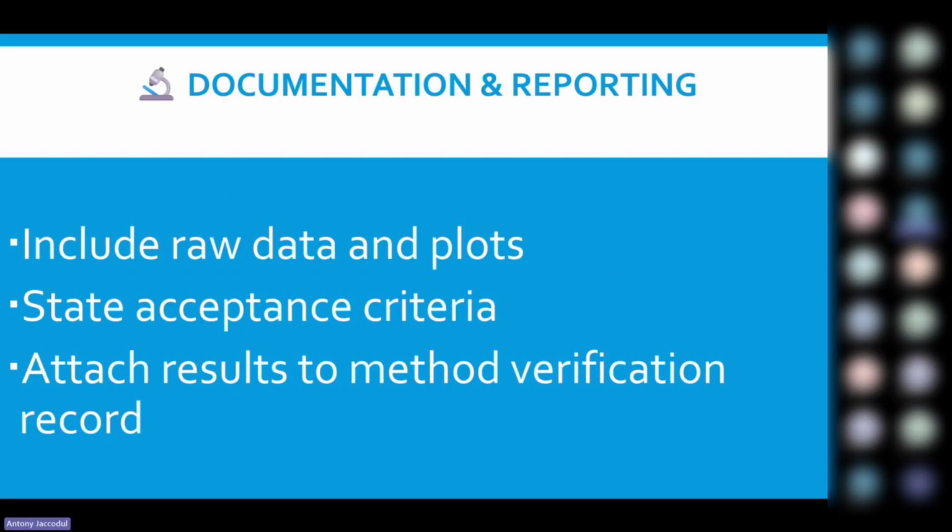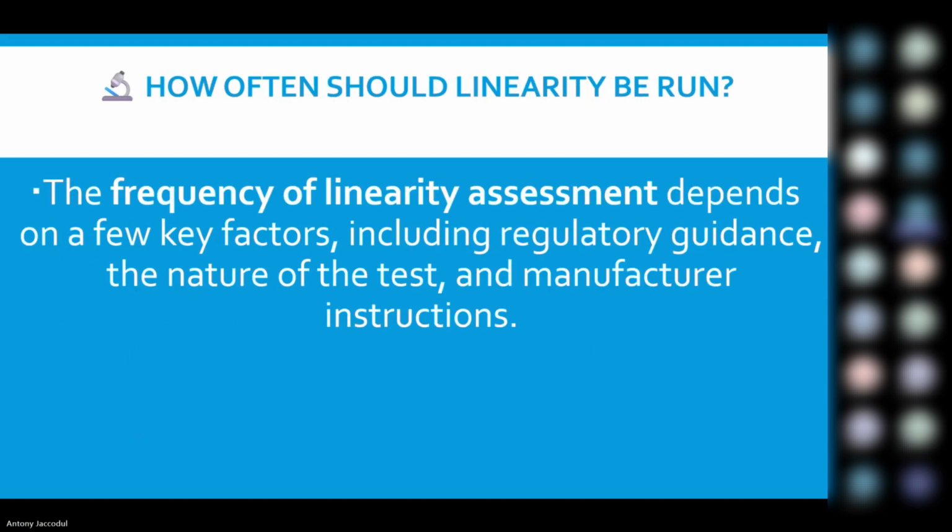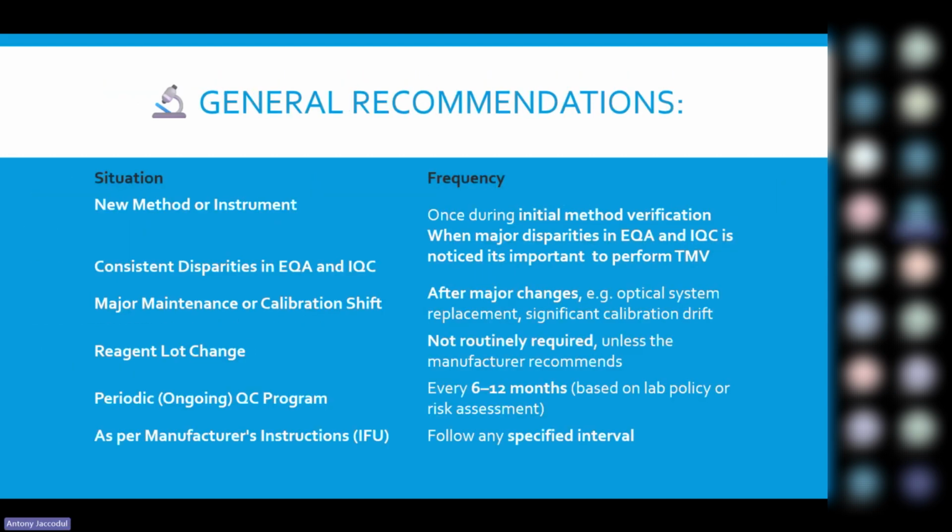Include raw data and plots. I think we already said that. Acceptability criteria: attach results to the method verification records. I think I've already done that. So, general recommendation.